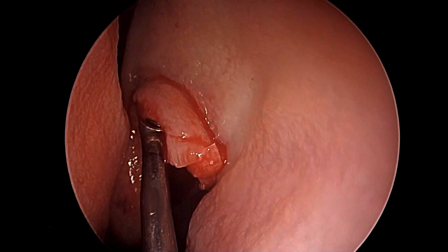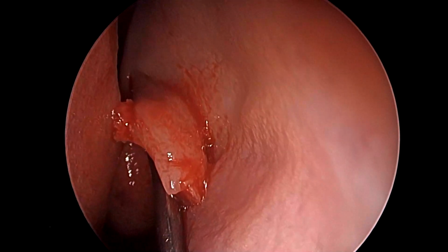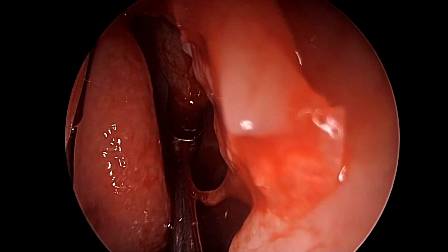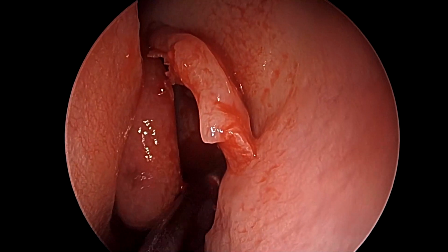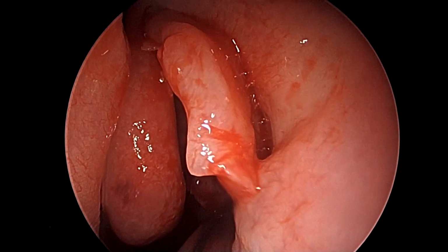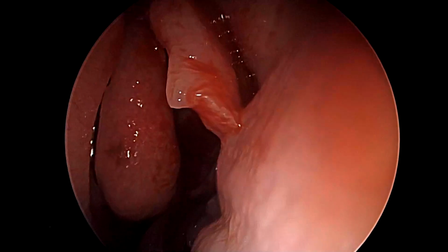Since we are to expose the base of skull, we make sure that the uncinate is fractured right till the axilla of the middle turbinate with no fragment remaining at the superior part, to give us unhindered access towards the ethmoidal roof or the fovea. If this were a cribriform plate leak, we would generally have to remove the middle turbinate for better access, but here we seem to manage without it.